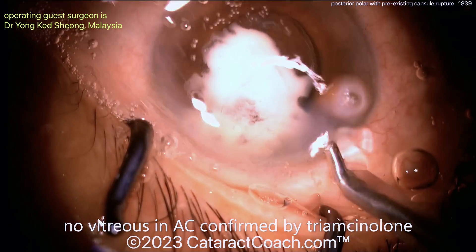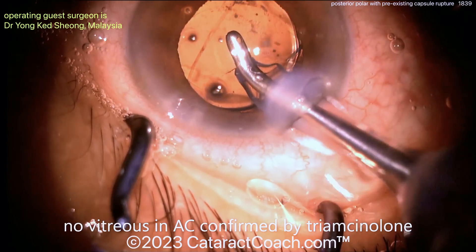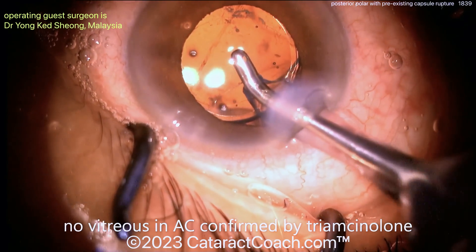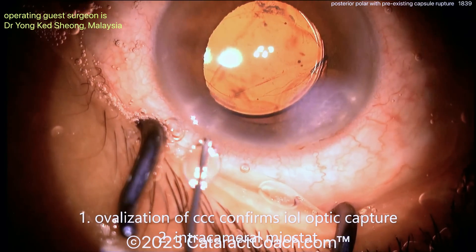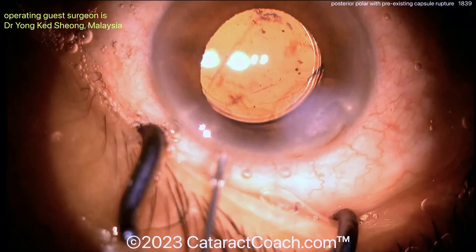That's going to be a very stable outcome and a very happy patient. Such great learning in this case. Here's the triamcinolone at the end, just to make sure that there is no vitreous prolapse — and it looks great, there's none. Intact anterior hyaloid face, beautifully done. I am very, very impressed, and you should be also. You need to learn about posterior polar cataract cases.